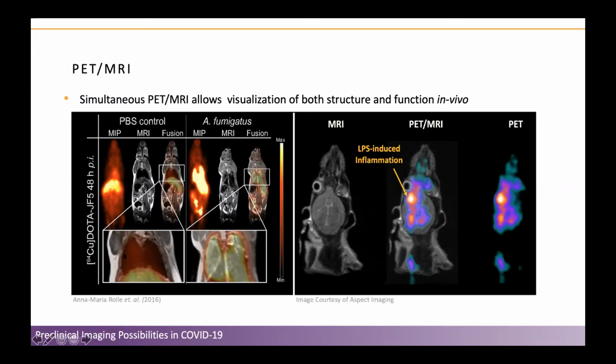Well, there's not much here. And then we see with the fungal infection here, we see a large accumulation of that radio tracer in the lungs. So again, another way to look at different inflammatory processes and different infection processes in the lungs.